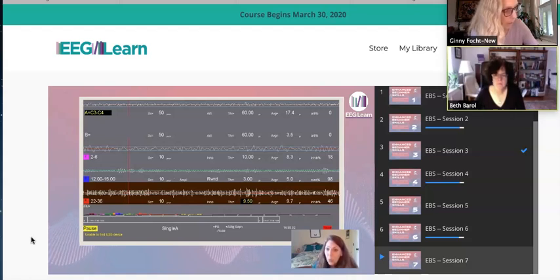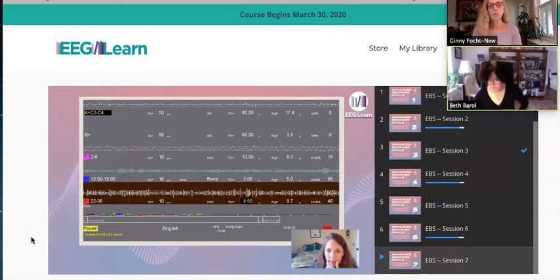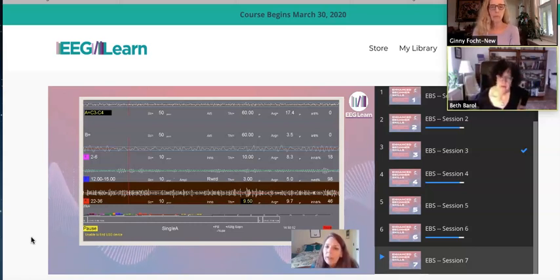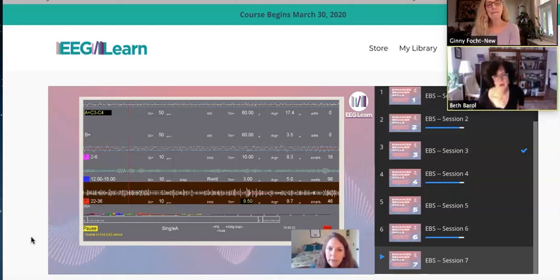And that's kind of cool because we've got a mixture of tasks there, and that really prevents someone who had way too much similarity between these two sites from hedging our bets like this, where they have to increase the difference in certain frequency ranges while decreasing the difference in others, which helps prevent someone from going from way too similar activity to way too dissimilar activity. And you can trust their brain to sort it out the way that it wants to.